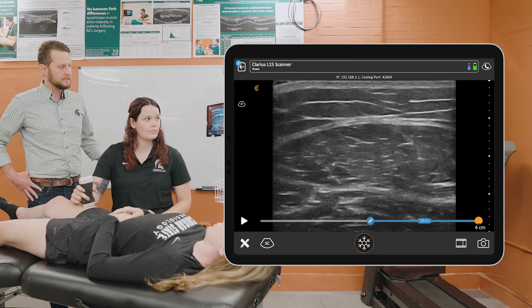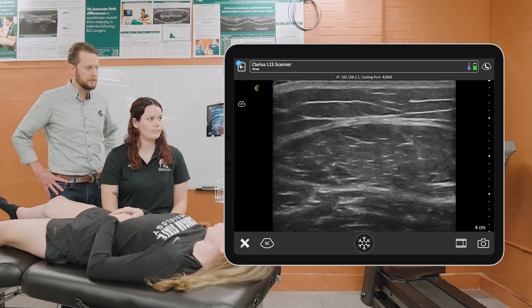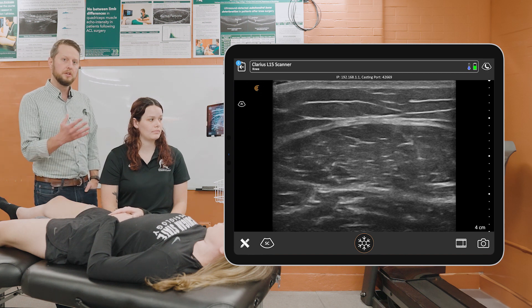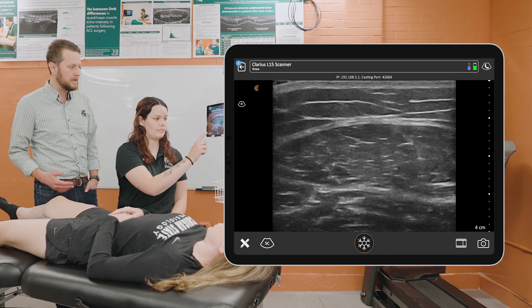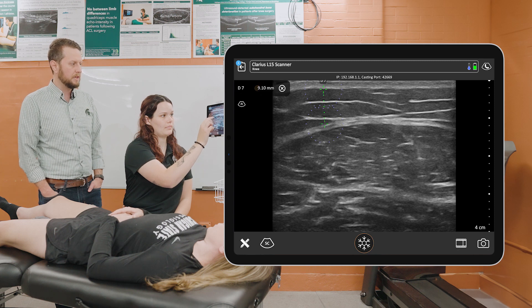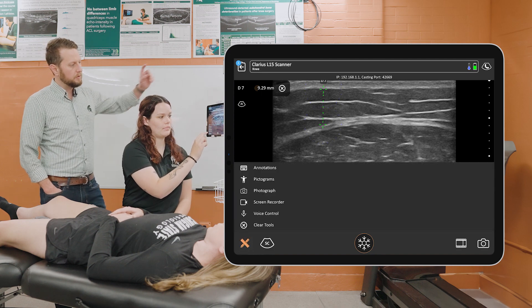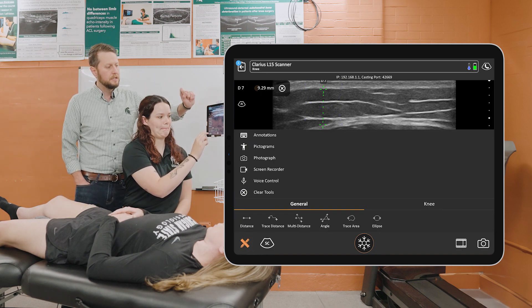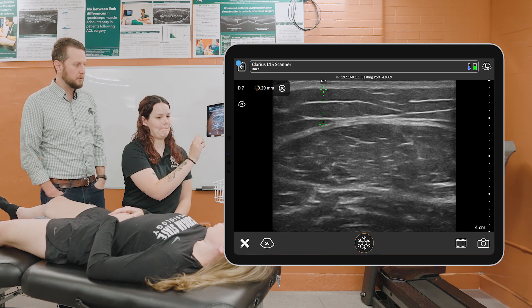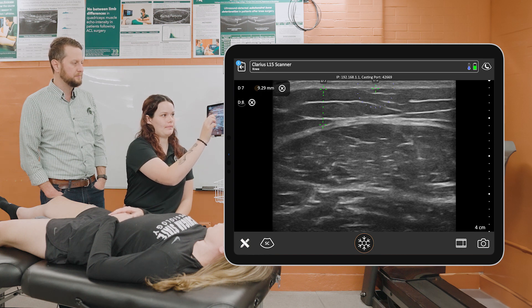Once we freeze that image, what we're going to be focusing on is the thickness of the subcutaneous fat. We can use the Clarius app itself to go into that measurement. Jess is going to show that we'll place a thickness line on the left side of the image going from the subcutaneous fat to the fascia overlying the rectus femoris muscle, one again at the midpoint of the muscle, and then another thickness line on the right side of the image.